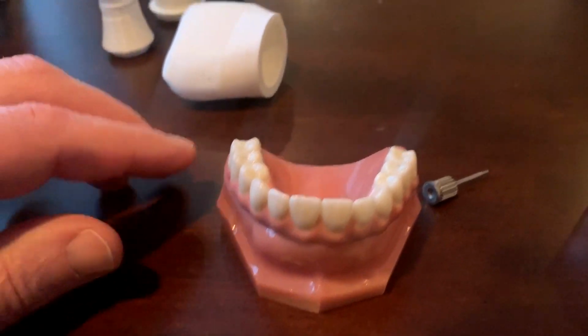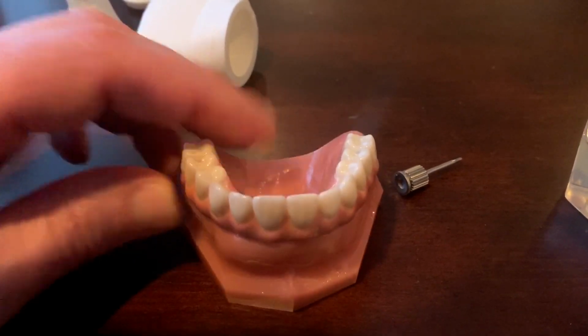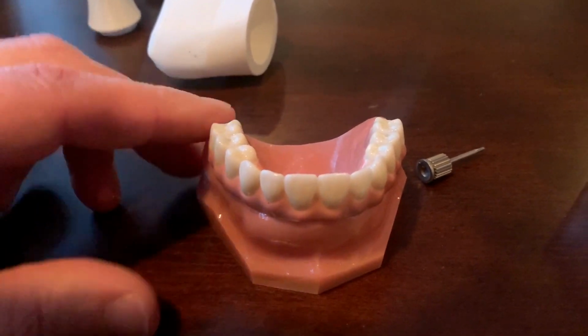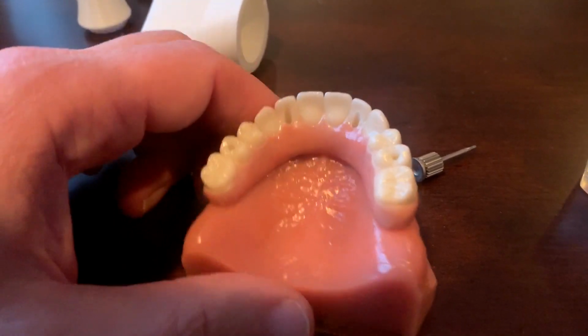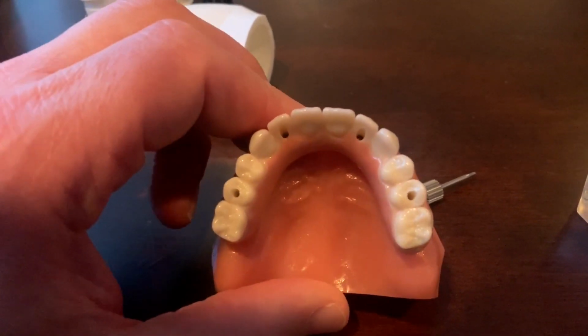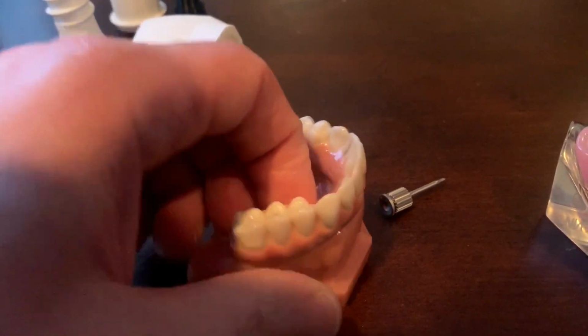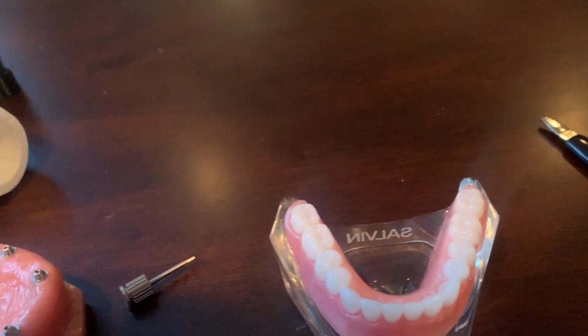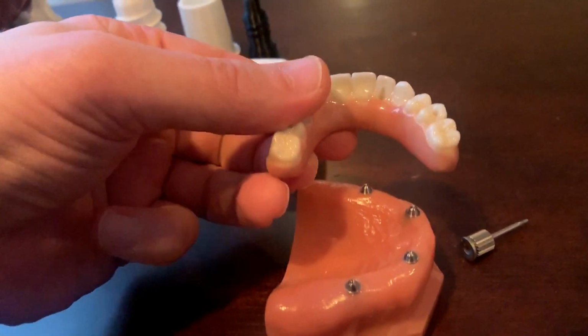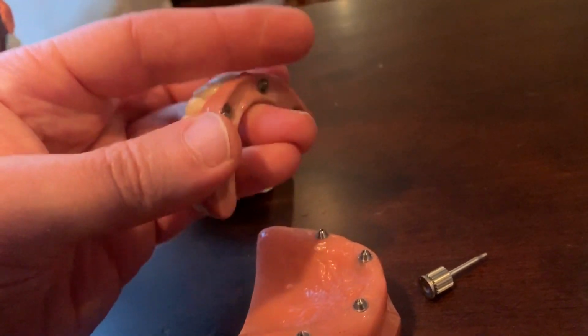Okay, so these are the different full mouth implant options that I was just discussing. This right here is the all-on-4 or the full mouth implant bridge. As you can see, this is a one-piece bridge. Well, I'll take this out and show you what this looks like.